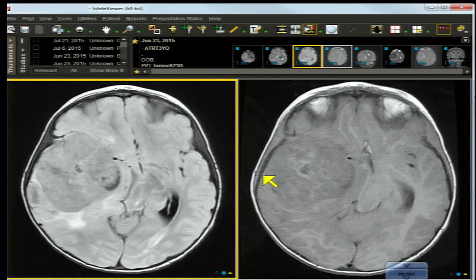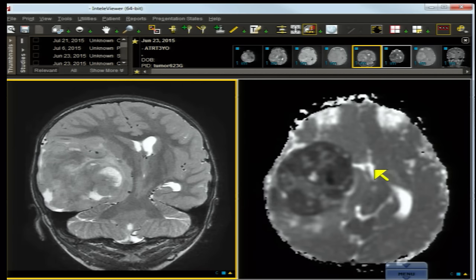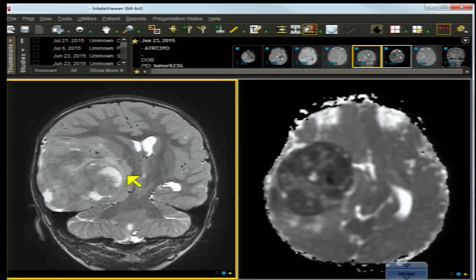On the axial T1-weighted image, look at the acute angle between the lesion and the white and gray matter — an indicator of a parenchymal, intra-axial mass. There is midline shift, another indicator of a severe, life-threatening lesion. The coronal T2 once again demonstrates an intra-axial position, further supported by the absence of a membrane, rim, or pseudo-membrane between the lesion and the parenchyma.